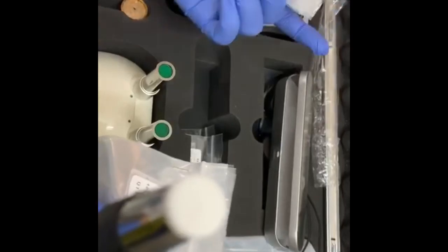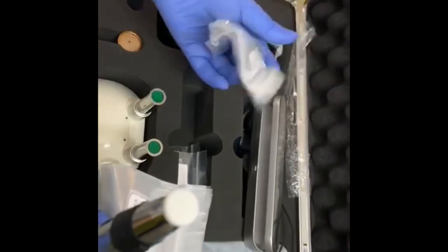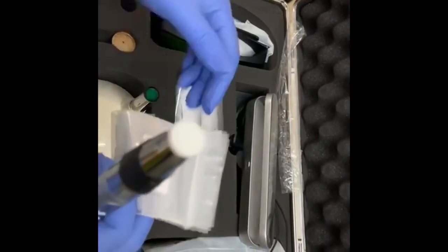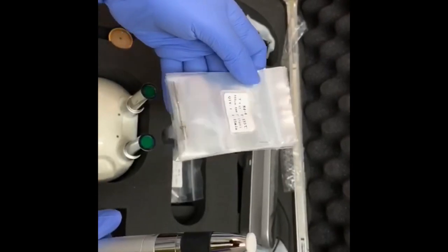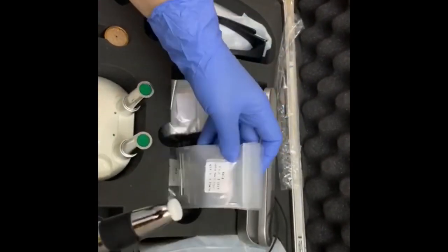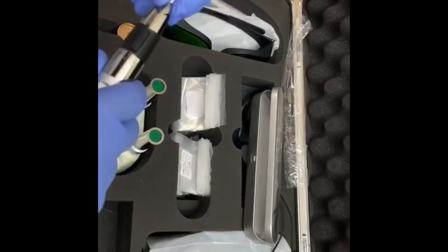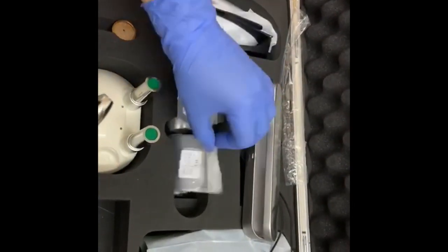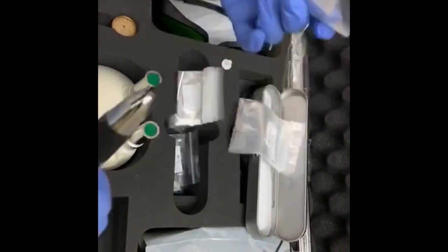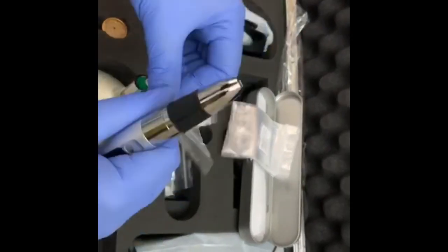The long tips are for perio and for endo and the short ones are basically for excision and crown lengthening. Let me just show you one tip and then I will show you on the patient also. I am doing one crown lengthening patient right now.